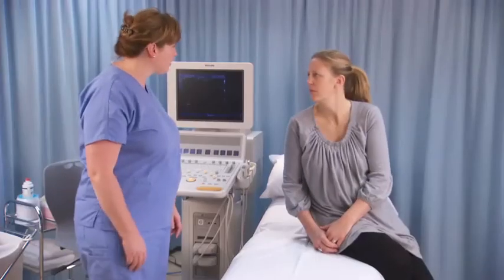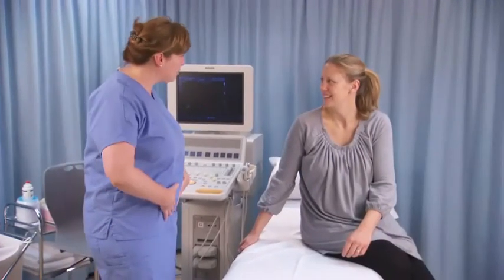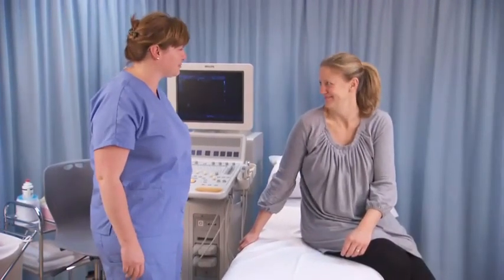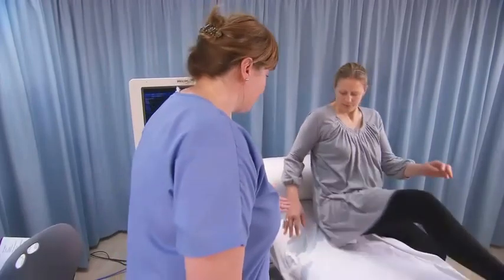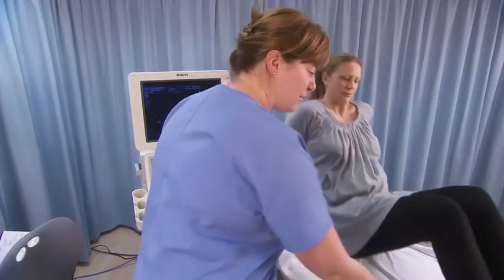Check the patient's details and medical and obstetric history. Confirm that she has a full bladder. Ask the patient to lie on the examination table and make her comfortable.